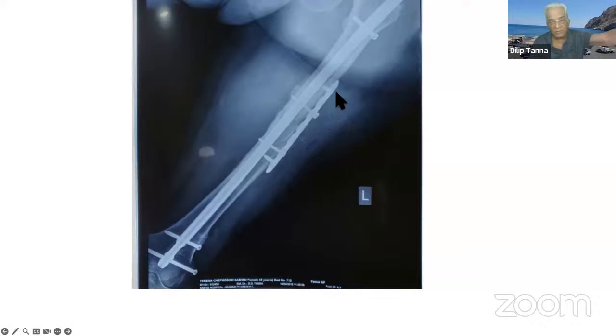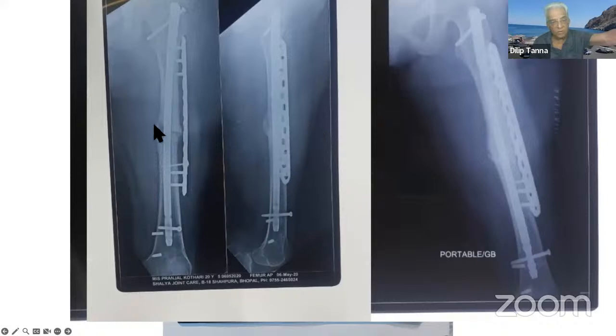And all these are the fractures which in a non-union, we always treat with the plate and the graft. So this is the one which all of us have been treating, and we know very well how beautifully it is done. Now, the only observation is, when you put a nail and you put a plate, the healing takes a long time. Radiological healing takes a long time. But the patient walks about and moves about without any pain. He goes on coming with the x-rays. At 3 months it still has not healed. And probably it takes 6 to 8 months for good callus formation and the completed healing which we see here. It takes a longer time to heal up.